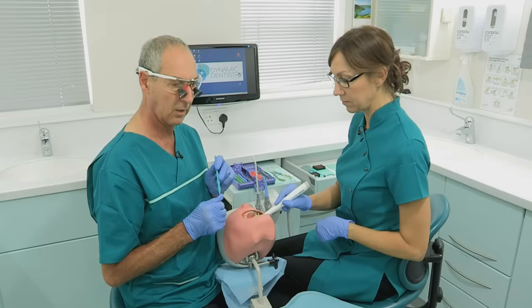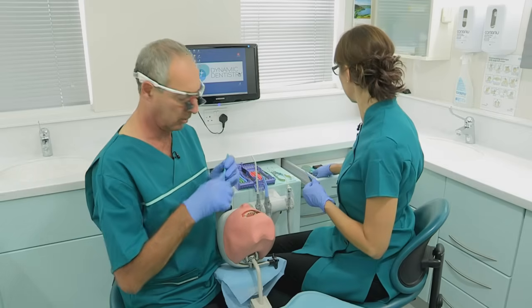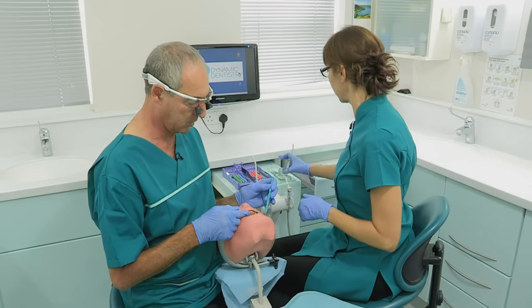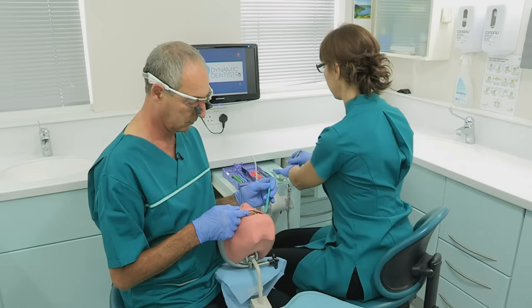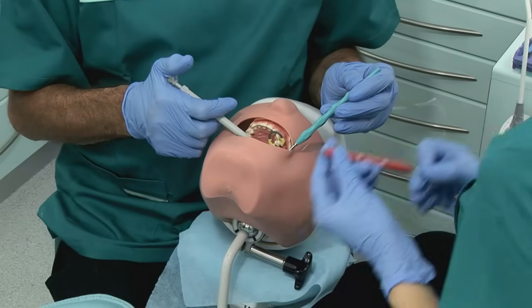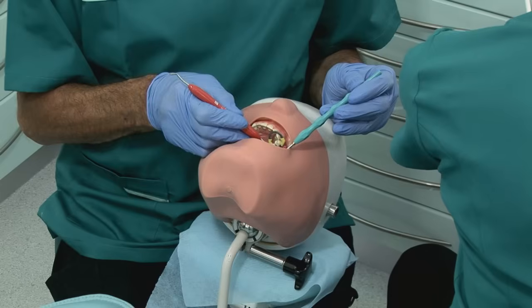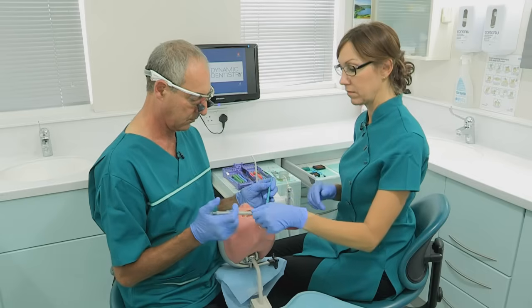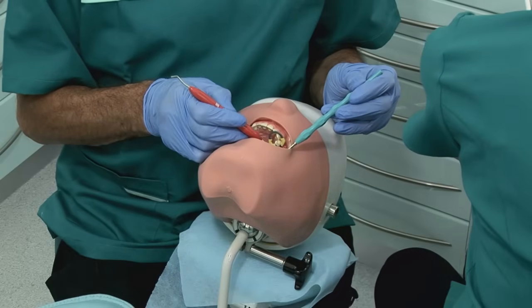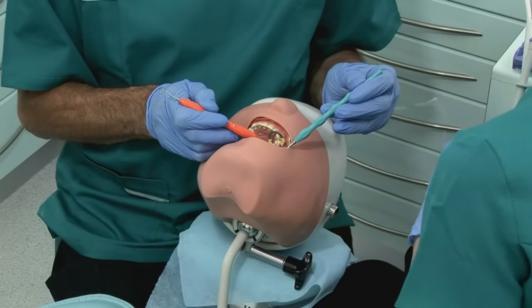And then Sally can do the light cure. Again, I don't have the light cure on my side. There's absolutely no reason for it to be here. It's going to be on the nurse's side. And now, depending on what you're doing, if you're doing an amalgam, we'll show you one particular technique for doing amalgam. You can choose your own. But the principle is, my eyes are on the tooth, everything's passed to me, and I'll condense it. I'm not looking up at all. And once we've finished condensing, I might want a ball-ended burnisher just to do a little bit more work on it.